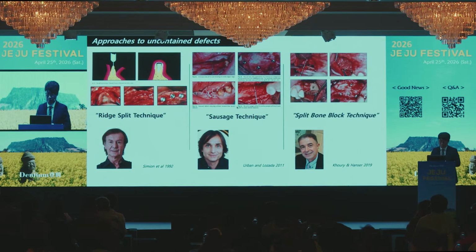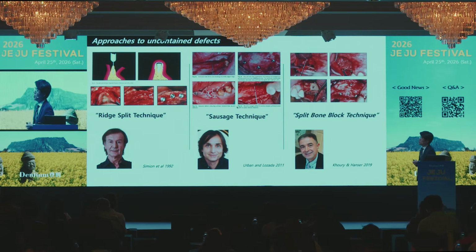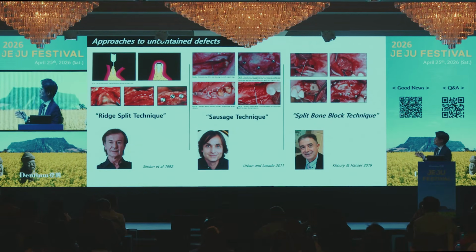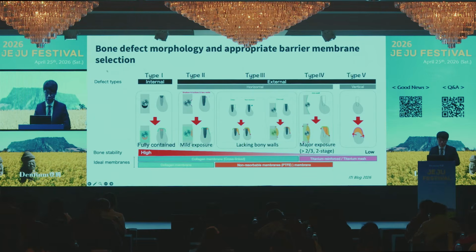Because of these limitations, many professors have provided several techniques: the ridge split technique, the sausage technique, the split bone block technique. Every technique has its own advantages and disadvantages. If you look at a recent publication from ITI this year, they emphasized selecting the membrane based on defect morphology.